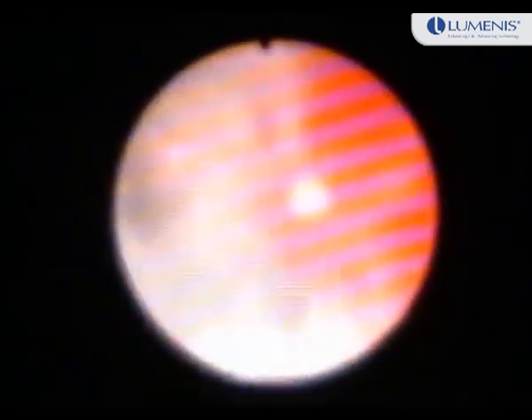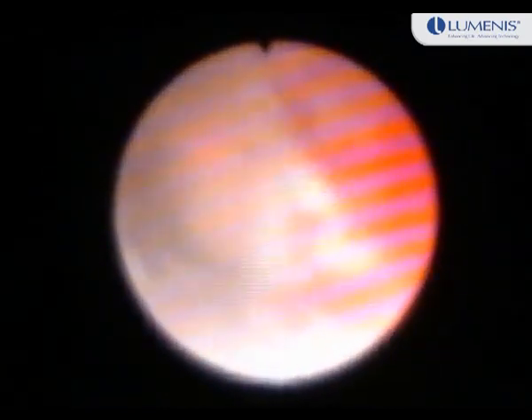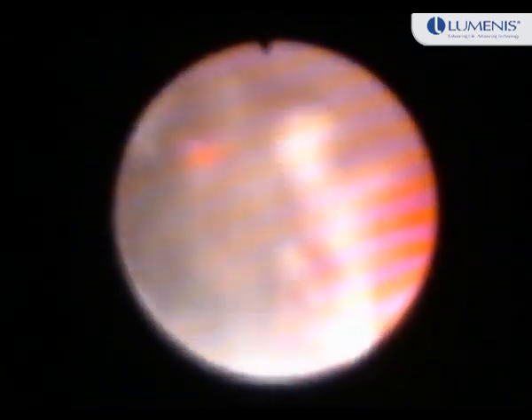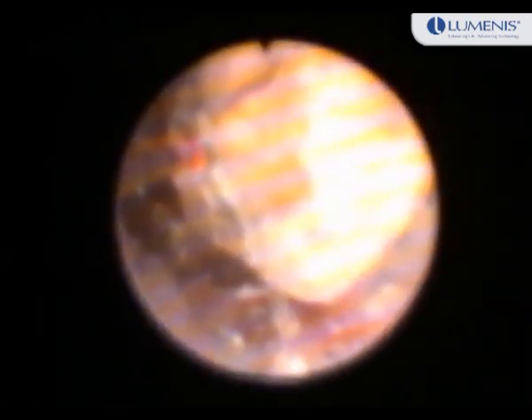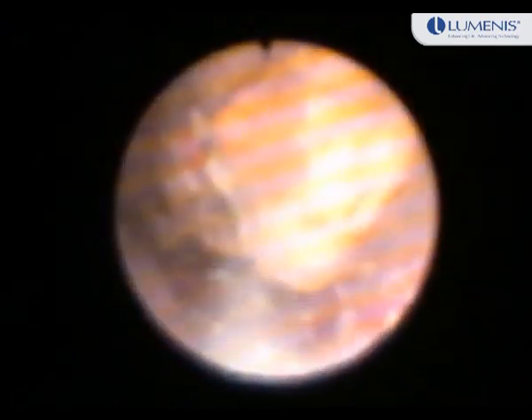By the time we were contemplating the second stage, we already had the stone analysis report, which showed it to be a cystine stone. As expected, it was relatively hard to fragment. We went back to high-power laser settings with low energy and high frequency, and took time and patience to pulverize the stone, starting from the periphery and then going into the center.